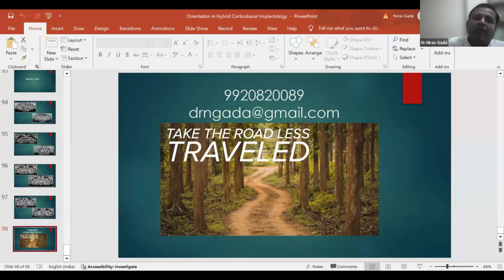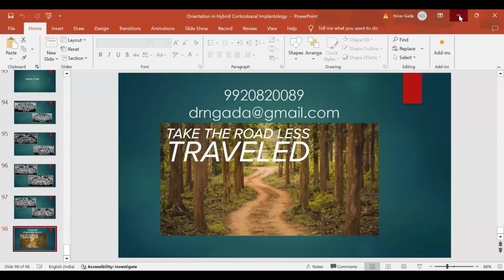I generally add a pterygoid because it's not a very big deal for us. We immediately add a pterygoid, and you should learn and you should add a pterygoid implant so that we can give excellent results without a cantilever.